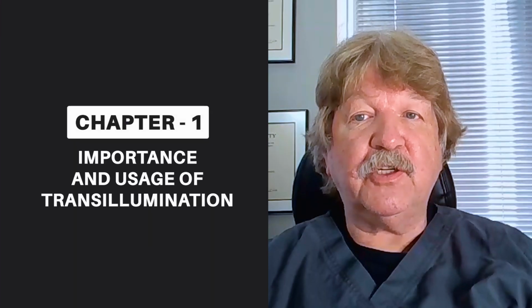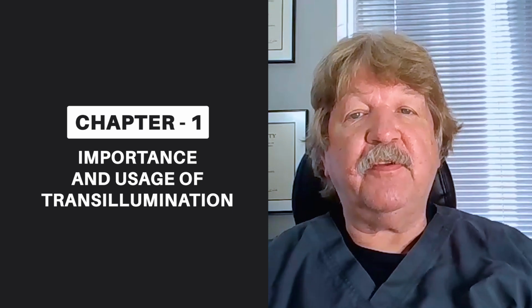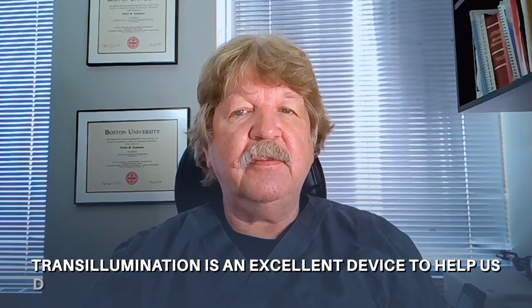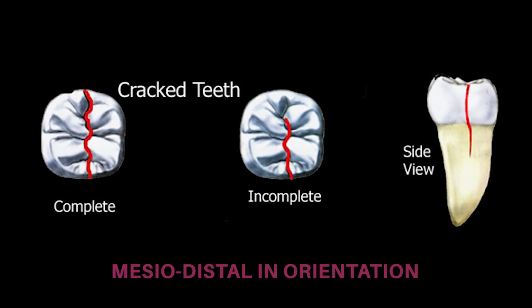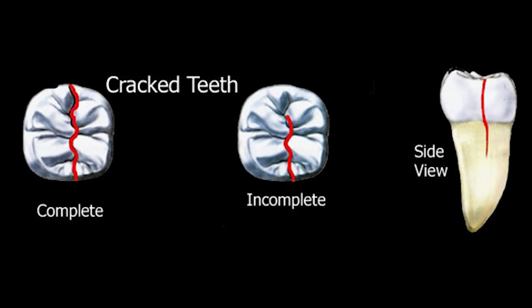In a recent lecture that I gave, I asked for a show of hands as to how many general dentists had a dedicated transillumination device. The response was surprisingly few. When combined with other clinical tests, transillumination is an excellent device to help us determine the location and extent of a fracture. The overwhelming number of fractures in teeth are mesiodistal in orientation, generally running through the central developmental groove.